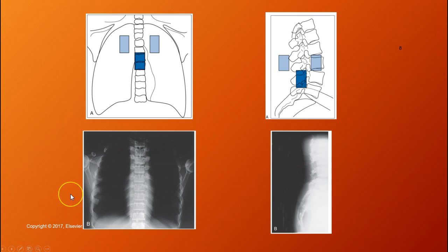As a result, your radiograph is way overexposed. The example for number 2 here is a lumbar spine. The lumbar spine is adequately using the center cell, however, it is not properly centered over the appropriate anatomy.